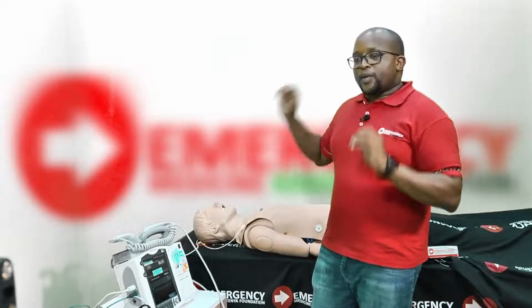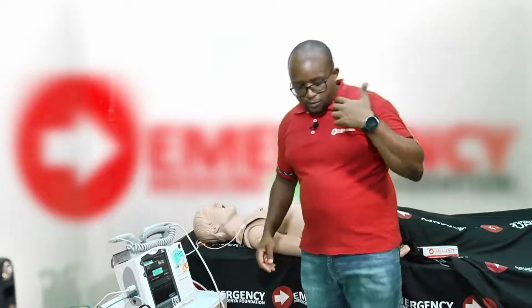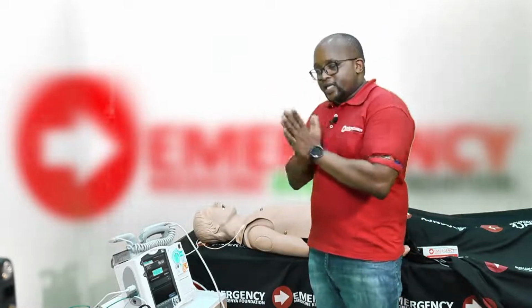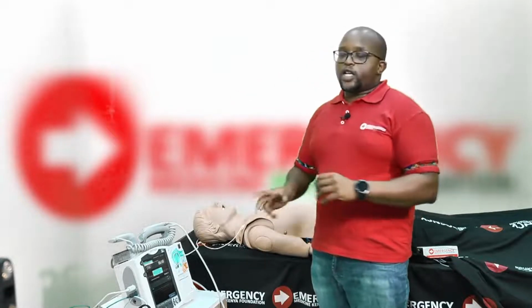Going through the key things is identifying the rhythm. So a patient who has collapsed, initiate CPR. When you're ready, check the rhythm.